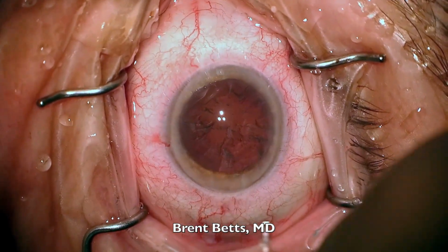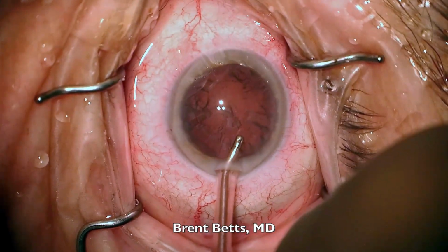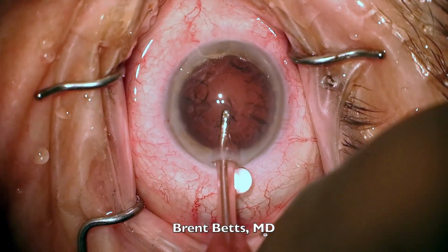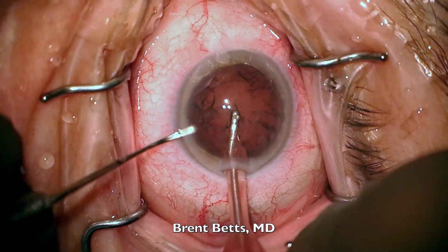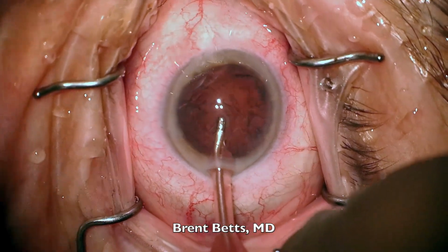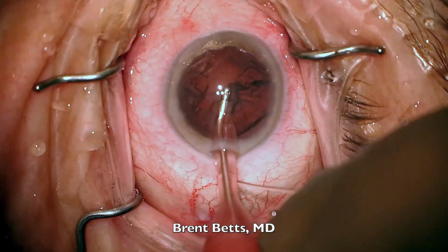Now that the dense part of the cataract is out, there is material left called cortex. It's the outer layers of the cataract. It's a stringy material. This instrument is called automated irrigation and aspiration. There's no ultrasound energy, but it does have a vacuum and it releases fluid constantly.